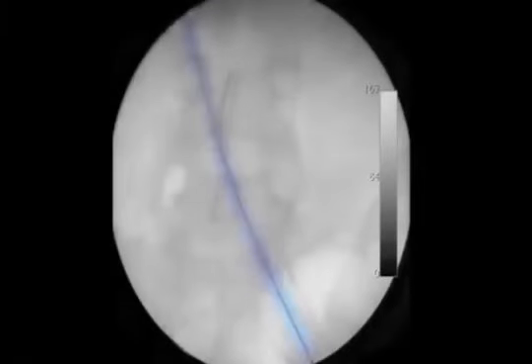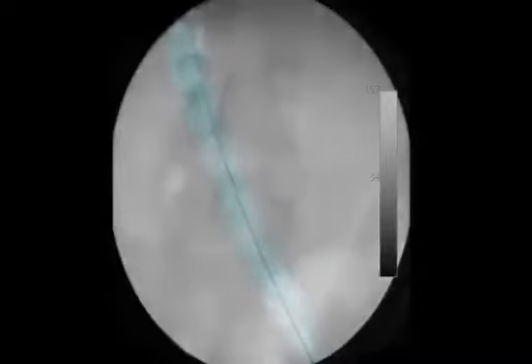This is the wire. You do everything over a guide wire. This is a stainless steel stent that's been deployed in the vein. What we've learned through the clinical studies, mostly from the Raju Negulin group, is that you want to have the proximal stent extending about 1 centimeter into the inferior vena cava. It's counterintuitive, but that's what the data show. The stent patency is better if you extend it into the inferior vena cava. So that's what we did in this case.